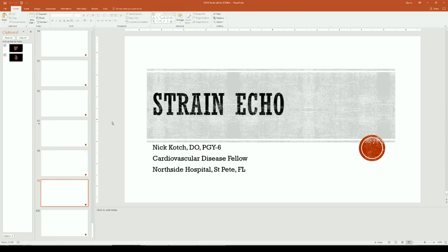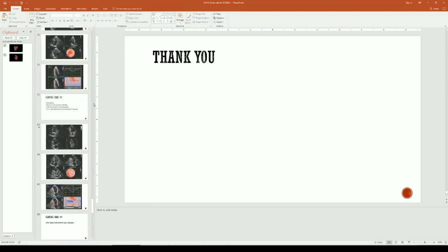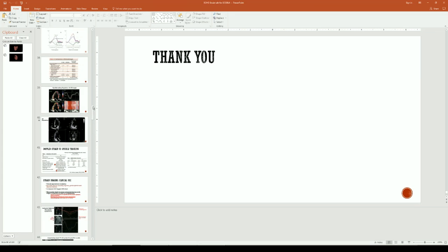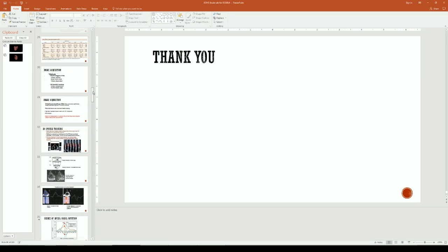But my question still remains: why and how can we differentiate these lower strain values in an abnormal situation from a normal situation? How can we believe it? Or can we only consider the global longitudinal average of the strain and not consider the regional strain in each segment?